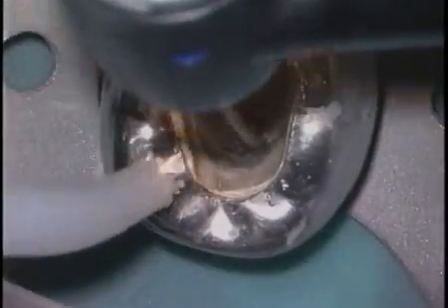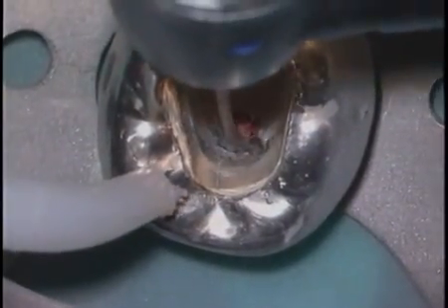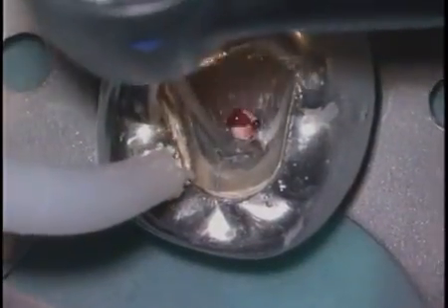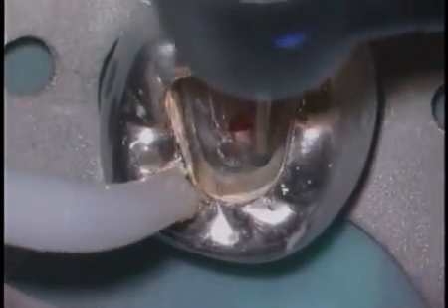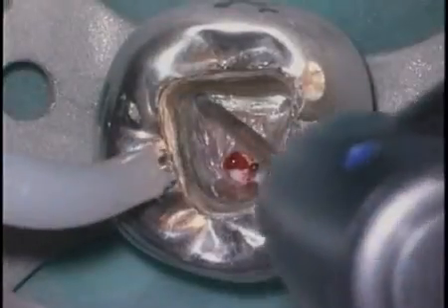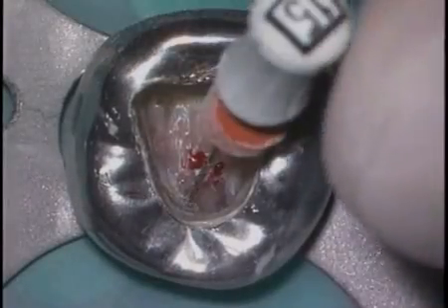Using a tapered diamond, we can flare back those walls, and it's amazing how you can begin to see nuances like fractures in some of these axial line angles. Gates-Glidden drills oftentimes can be used right at the orifice entry because that will face off the orifice and allow us to more easily introduce files during subsequent cleaning and shaping. However, one doesn't really want to worry about cleaning and shaping at this time. It's more important to make sure you can find all the canals.